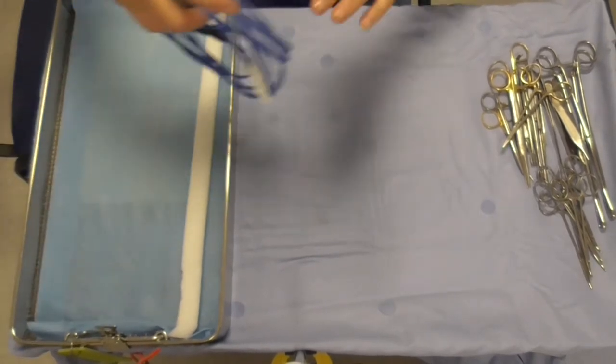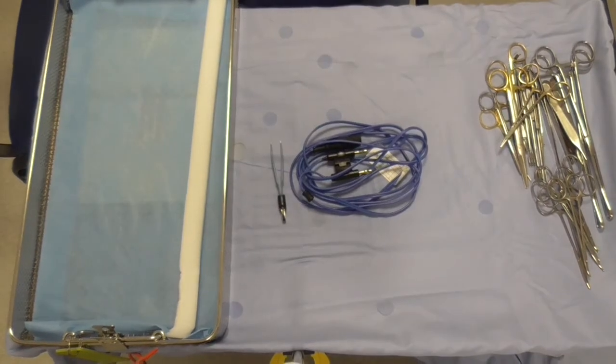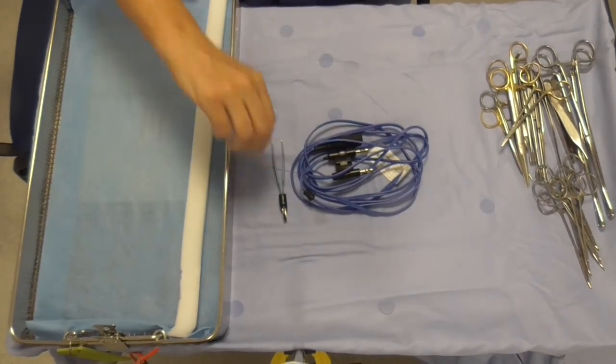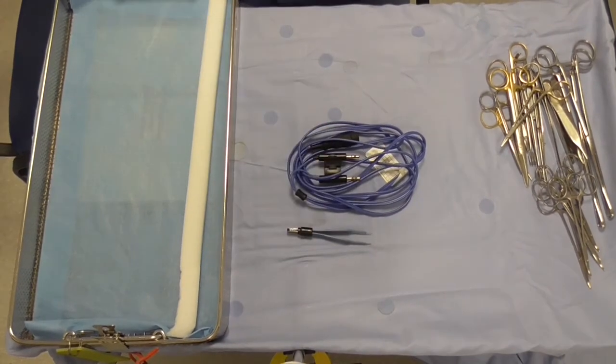Here we have the bipolar forceps and lead, which is used to stop any bleeding vessels. So that's the plastic surgery tray in a nutshell. Thank you.